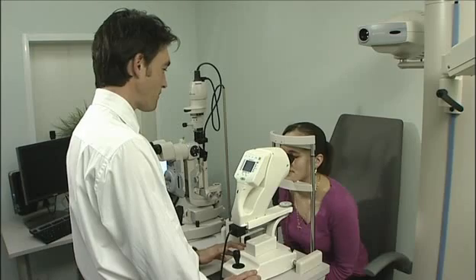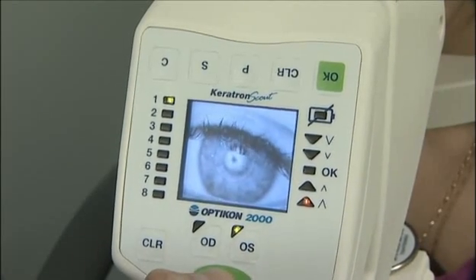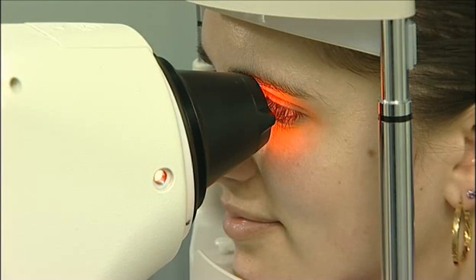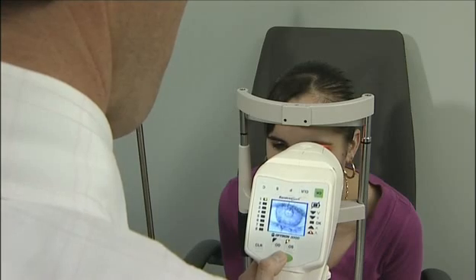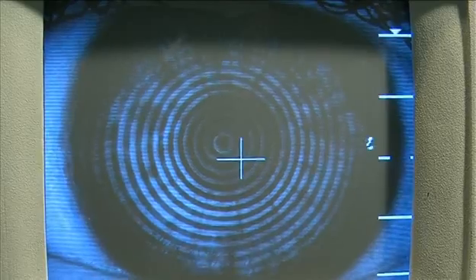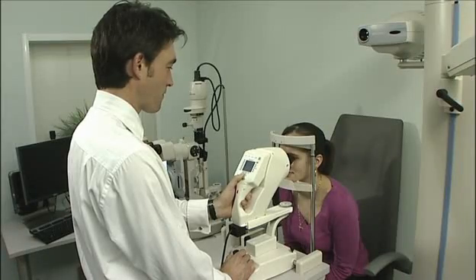A topographer is a computerised instrument that enables more efficient contact lens fitting by accurately mapping a cornea's topology to measure its refractive power. The Keratron range of topographers measures 90% of the corneal surface, analysing over 80,000 reference points and measuring more than 7,000 — a substantial increase on the two axes measured by keratometers.